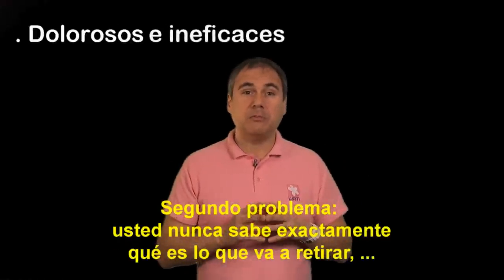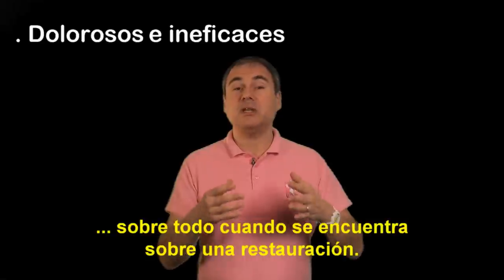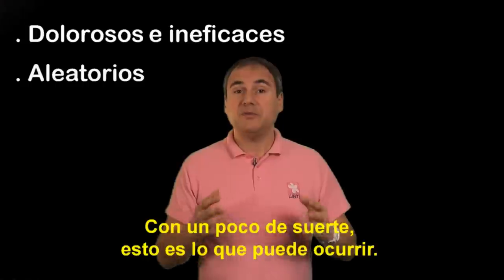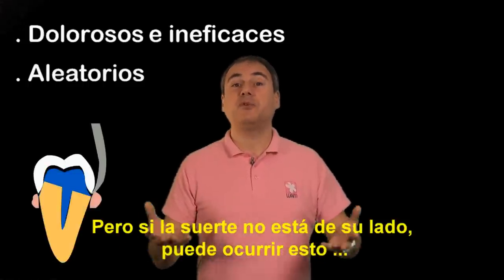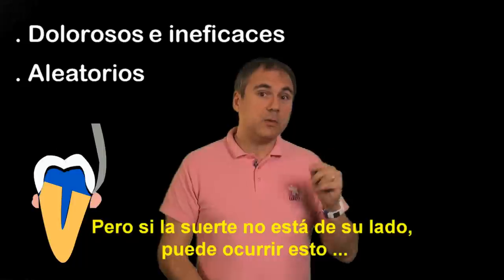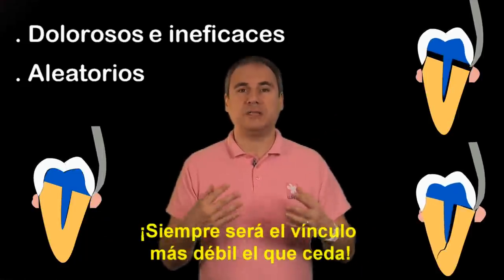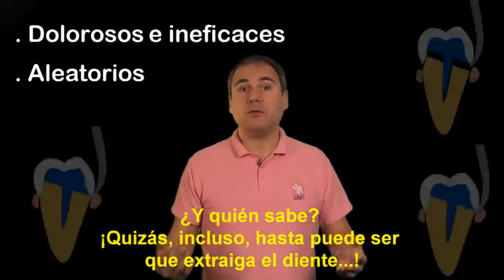The second problem is that you never know what you are going to remove, especially when dealing with a build-up under the crown. If you are lucky, this is what might happen — but if you're not lucky, this is what could happen, or even worse. The weakest link will always break, and you could even remove the tooth.